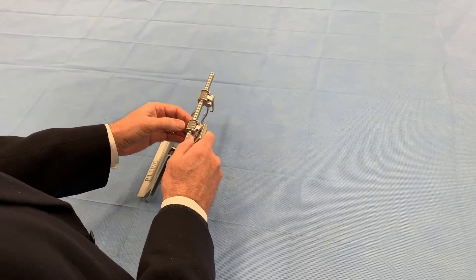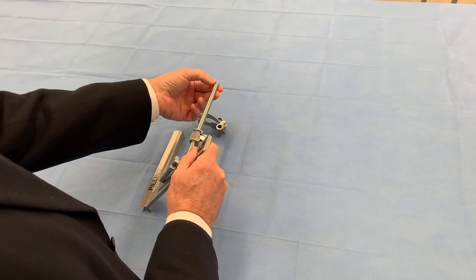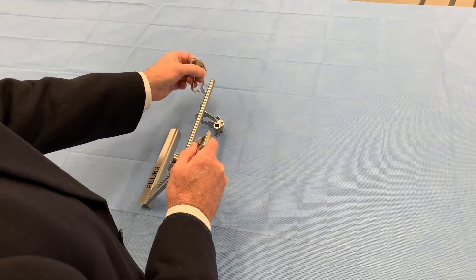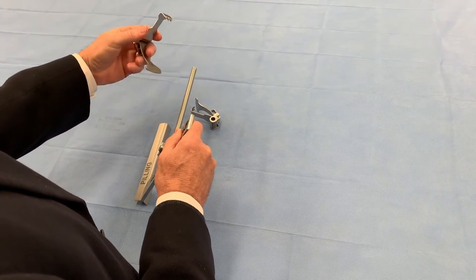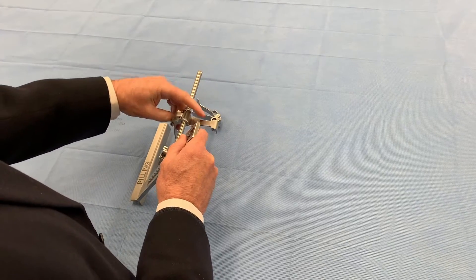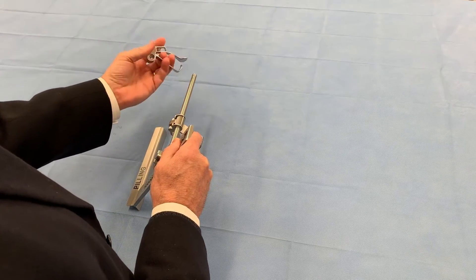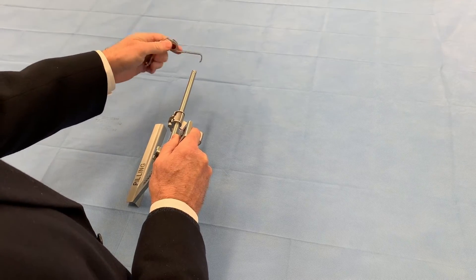Now if you're going to flip it the other way around, you take the blades off. There's a little ball stopper here that holds them in place — just push past it. Then you flip them around the other way so the wide blade is still at the bottom, closer to the rack.